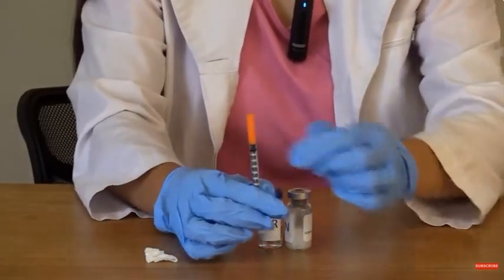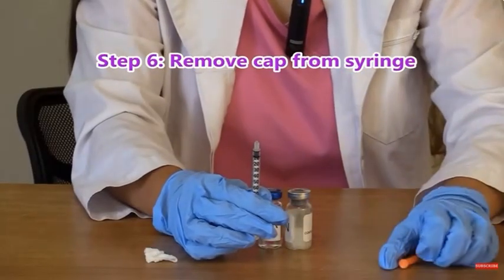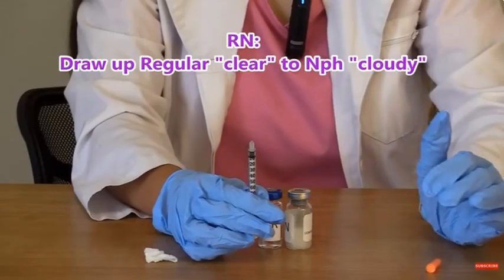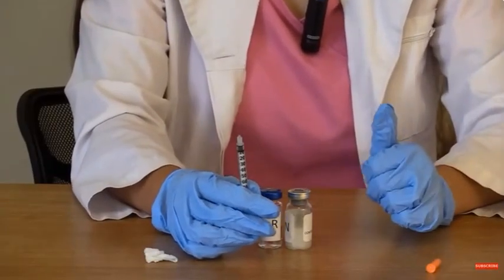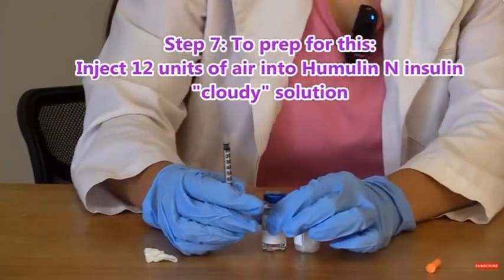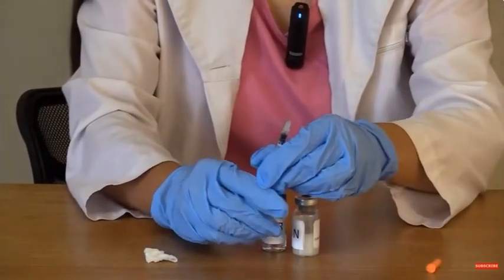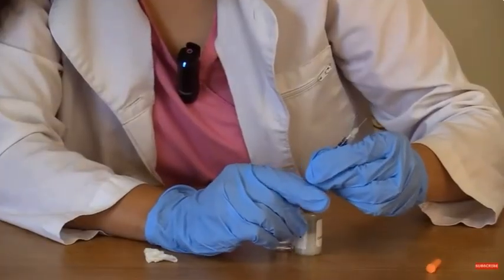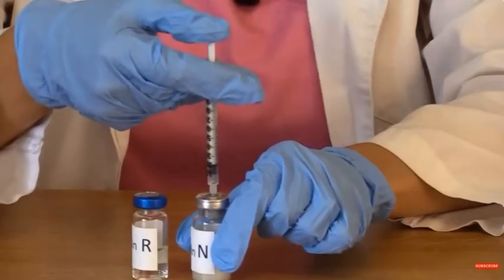You're going to take the cap off of your syringe, and remember the mnemonic RN: we're going to start with regular insulin and then go to cloudy. So it's going to go clear to cloudy, regular to NPH. First, we are going to inject 12 units of air into our Humulin N insulin. So just pull back on your syringe to 12 units, which is there. We're going to inject the 12 units of air into the vial.